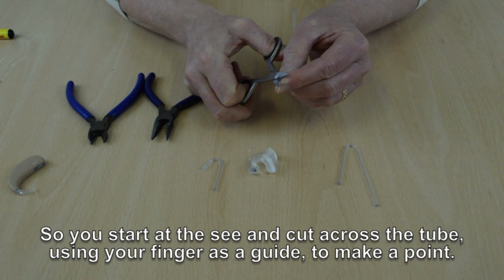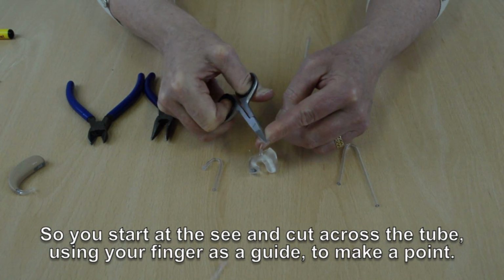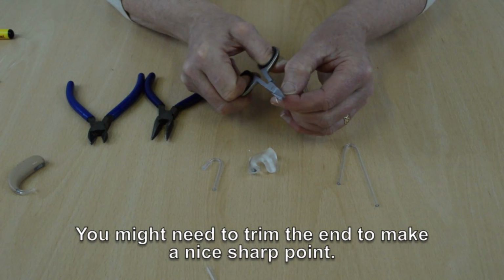So you start at the side and cut across the tubing using your finger as a guide to make a point. You might need to trim the ends there, just to make a nice sharp point.